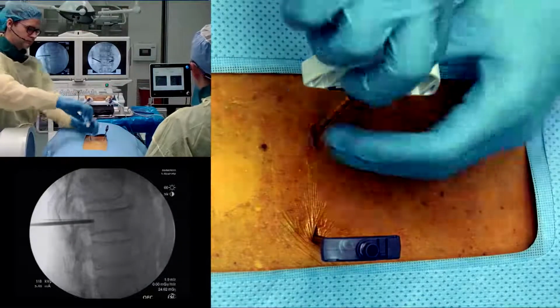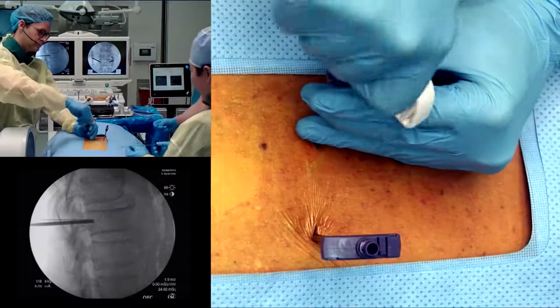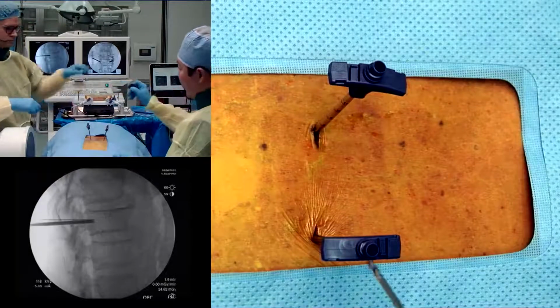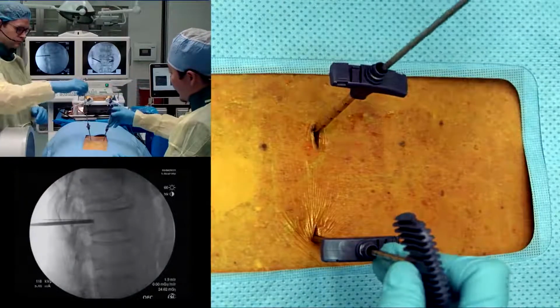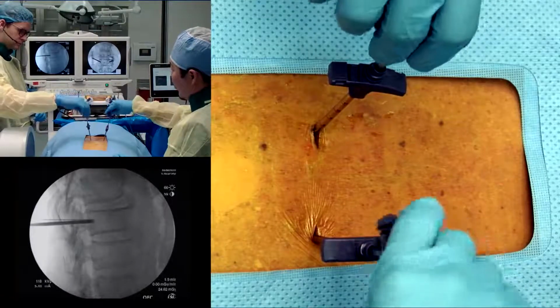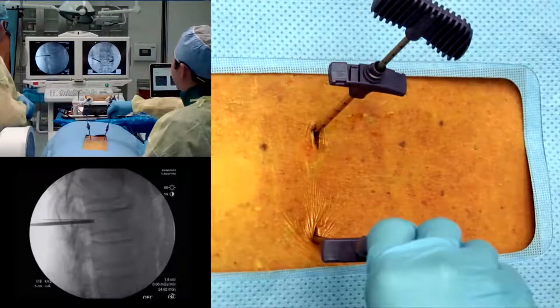Okay. Now we're going to take this drill to create a little pathway into the bone itself. And there are little marks here letting us know how many centimeters deep we are. So when I insert this, I know that I'm actually at the tip right there. So I'm going to go in probably about another centimeter or two. So I'm about a centimeter deep right there. Picture that. There we go.